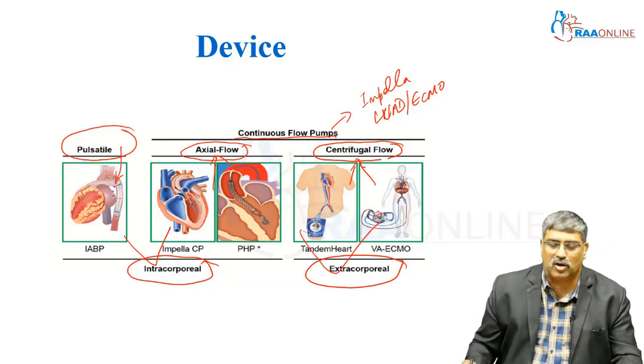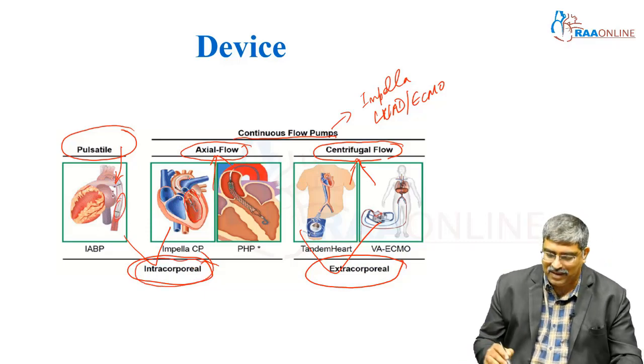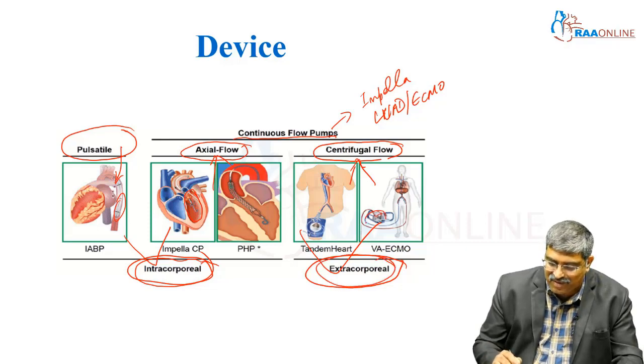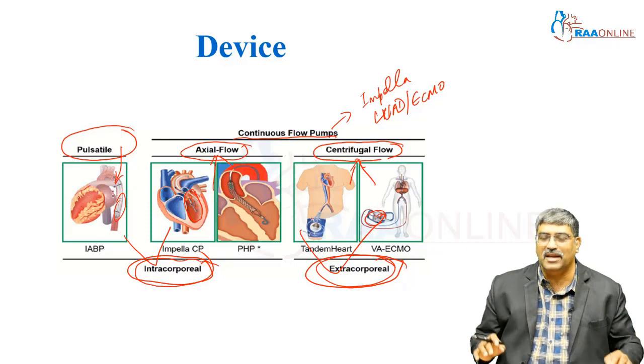What do you mean by intracorporeal? Here the device is inside the aorta or inside the heart. Extracorporeal means the device is outside the vascular lumen or outside the heart.